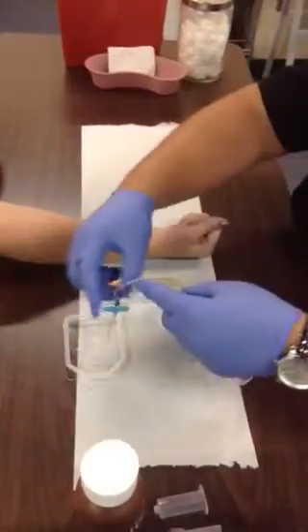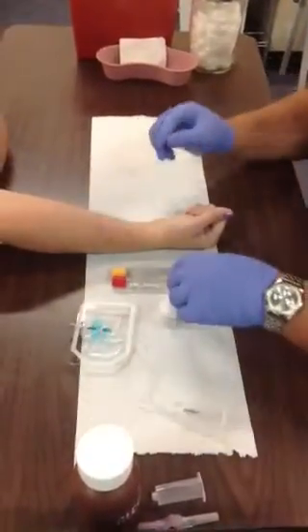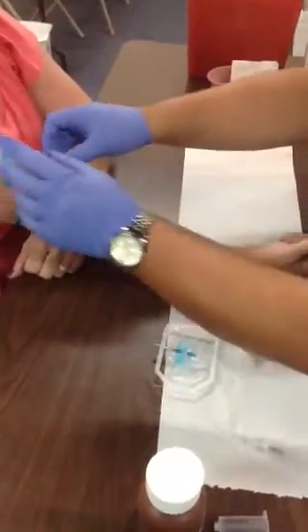Once that's done, take the needle and place it back into its sterile packaging, and put the tourniquet back on. Remember that once you find the vein, landmark where it is, because once you've prepped it, you can't touch it again. With this vein, I can see it.